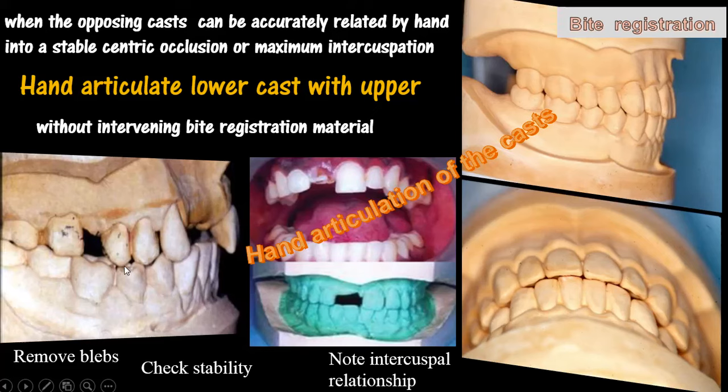So in this case you don't need any registration. Go ahead and do mounting.